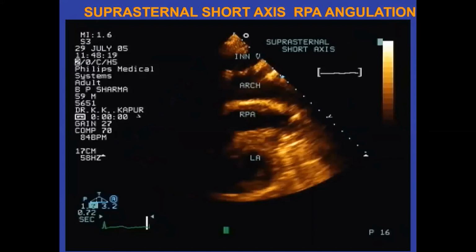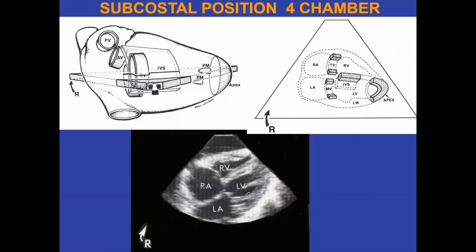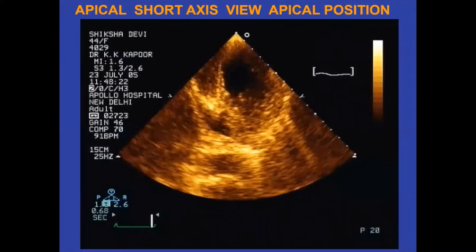So if you're getting back into your presentation, there's also a question which you might want to address there. Pooja Sinha has requested you to repeat the site of transducer placement in the right lower parasternal view and imaging from the back. So if you can take these two questions together. Yeah.